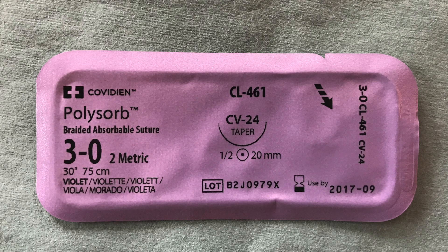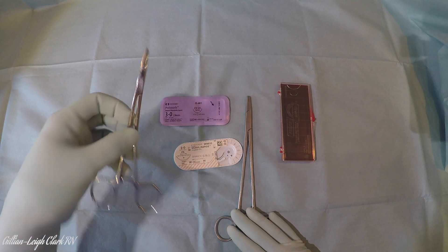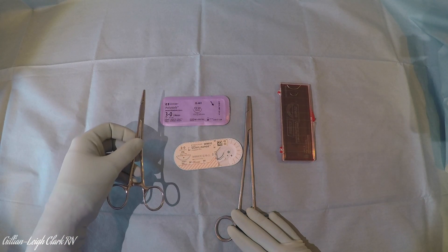I have a 3-0 also, and the packet represents exactly what size the actual needle is. That would be far too small to go onto this massive Mayo needle holder, so I'm going to use this needle holder for the smaller one.